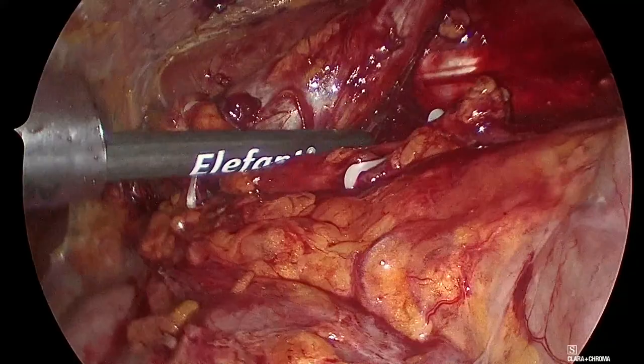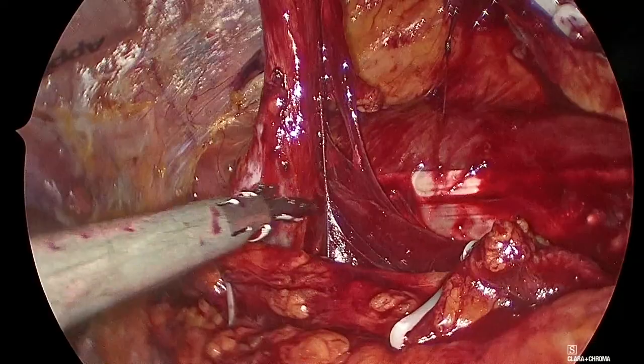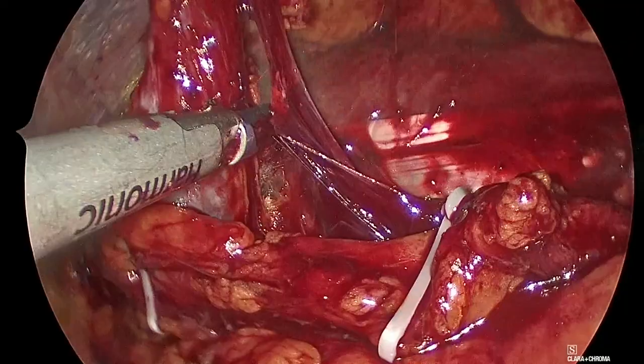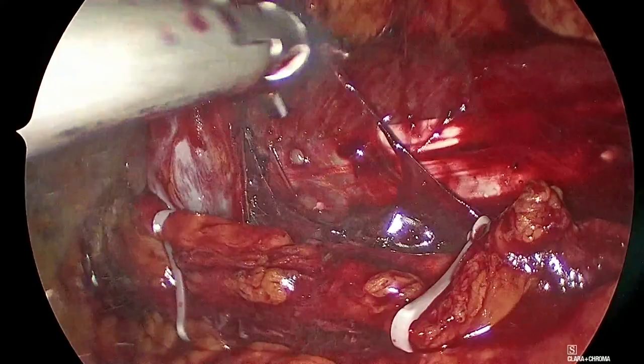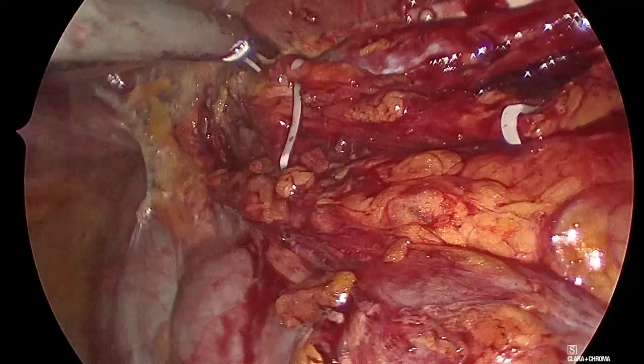Here it is. So I think that the tumor is here, because in the CT scan and in the urography, it's where it looks like it is. Come closer. So we clean this, and then I think we are ready to go with open extraction. Okay, let's go here. Give me a normal forceps. Good.